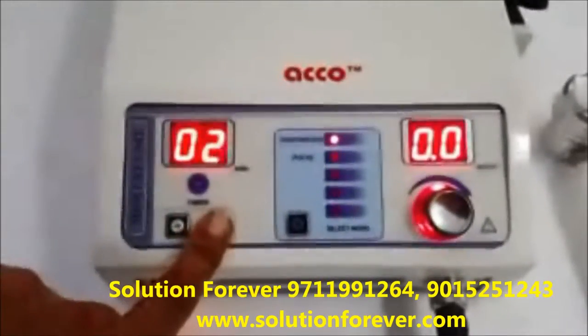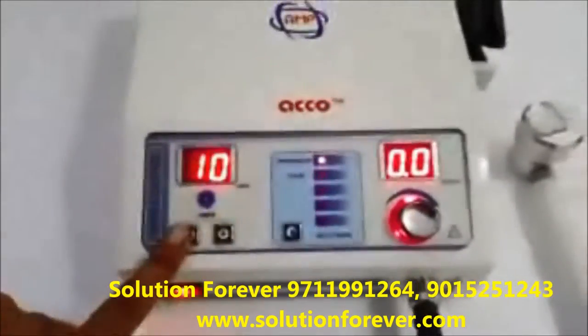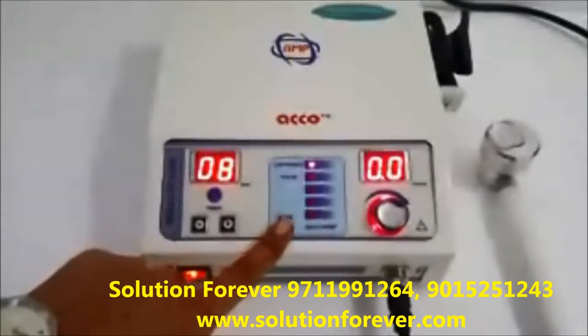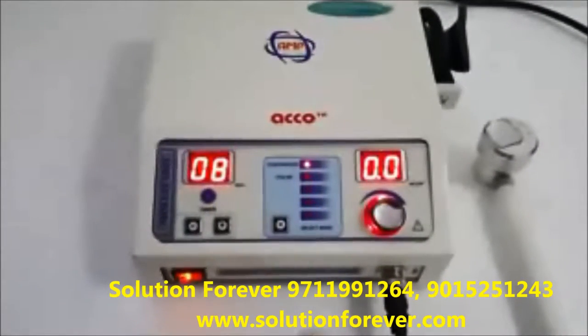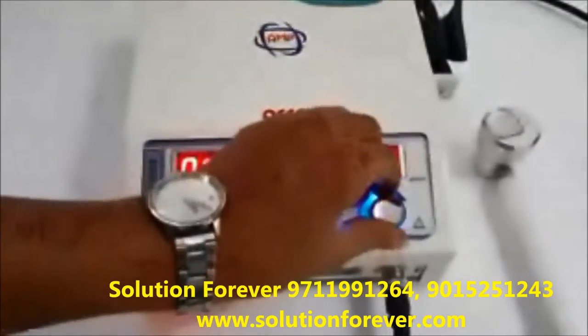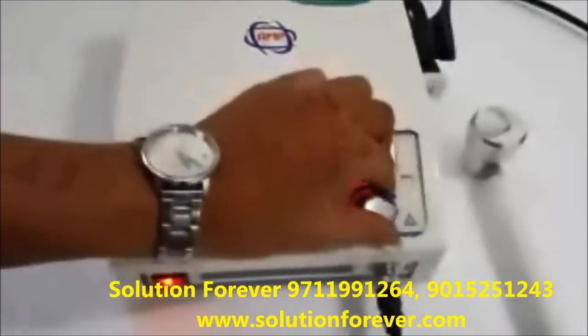Set the timer as per your need. Timer up, timer down. Set the mode as per your need. To start the treatment, press this knob again. Increase the intensity as per your need.